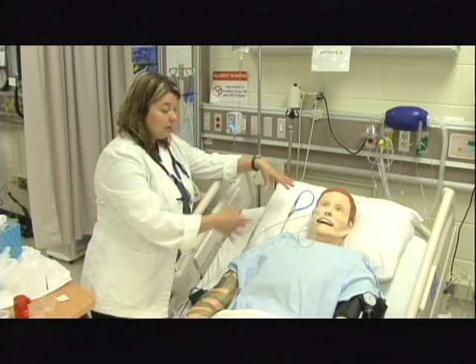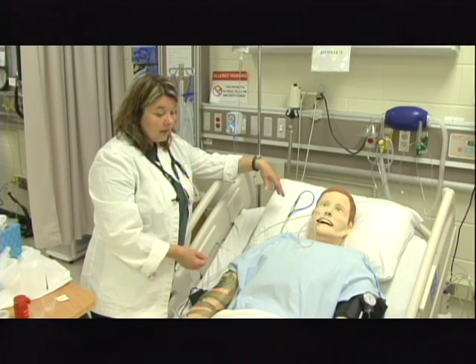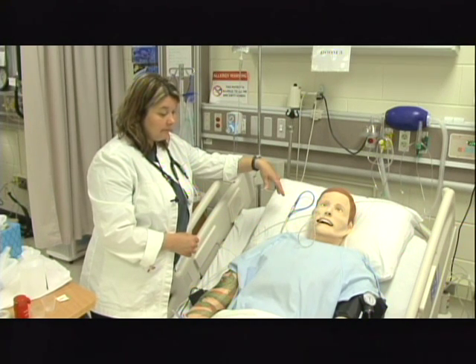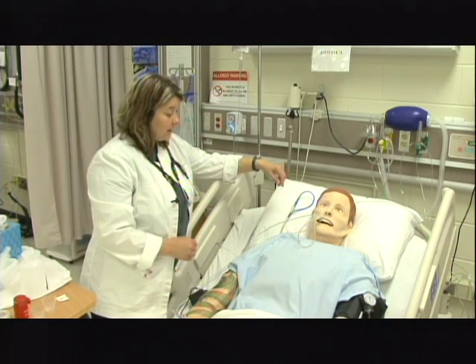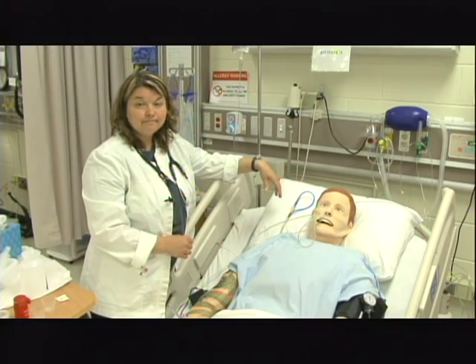But I don't want to do it any earlier than that to make sure they don't suction out any of the medications. Before I leave the room, I need to thank Mr. Smith for allowing me to care for him today, and then make sure he doesn't need anything else before I leave, and then I'm now done with giving the tube medications. Thank you very much.